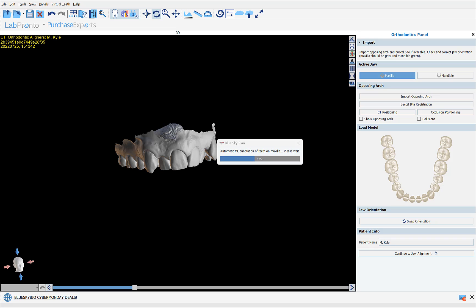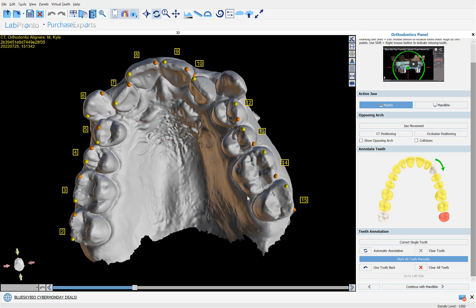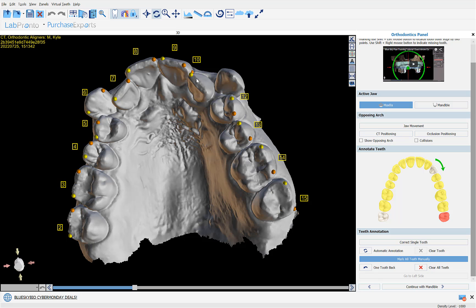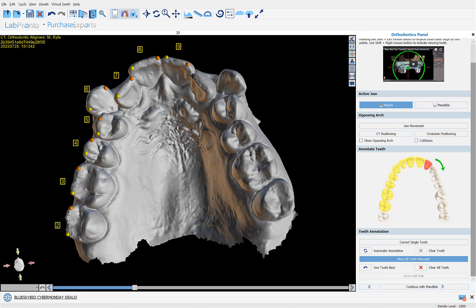The software will proceed to automatically annotate, placing two dots on each tooth going around the jaw. The annotation on screen was done completely automatically by the software. We can see that there is an issue with teeth 10 and 11. To adjust the annotation, simply click one tooth back, erase the last few teeth, and help the software by holding down the shift key and clicking with the left mouse button in the relevant locations to modify the annotation.